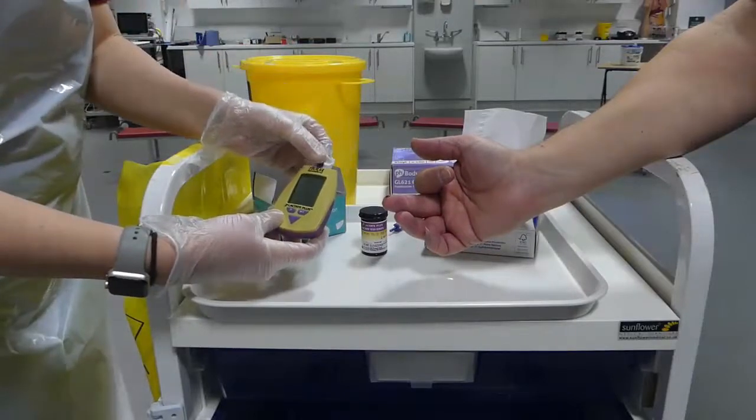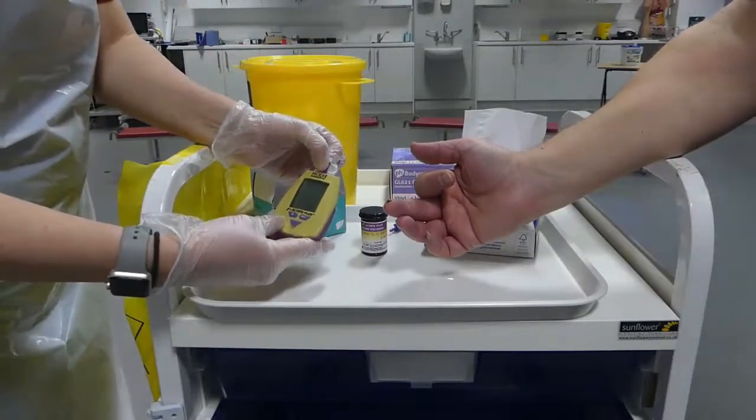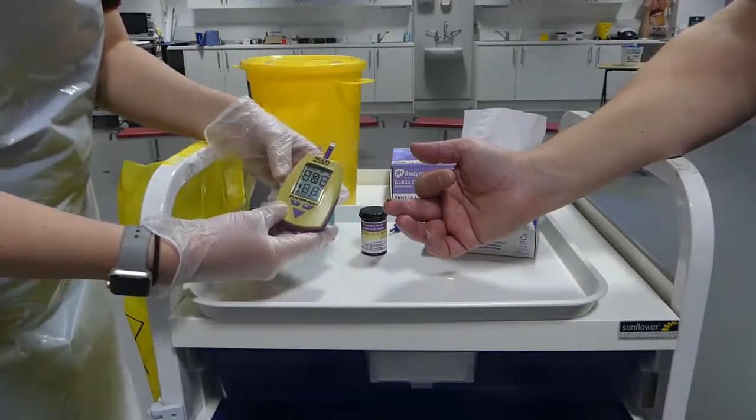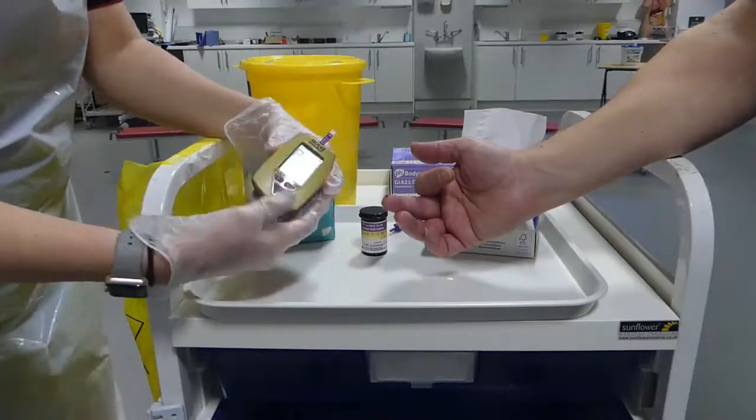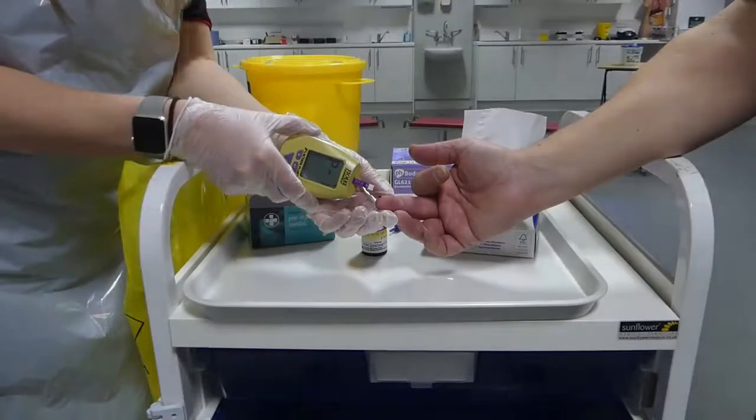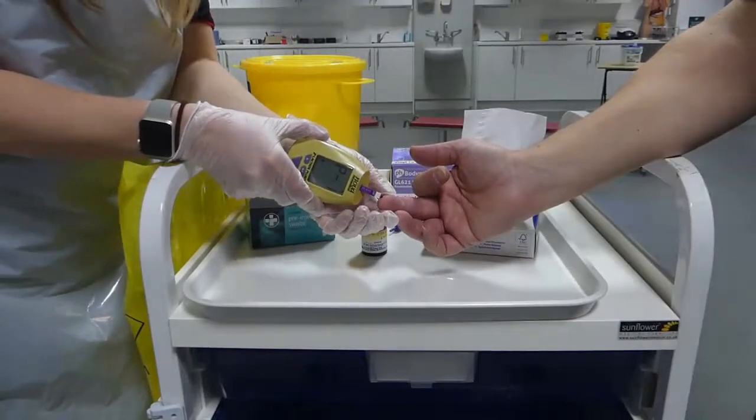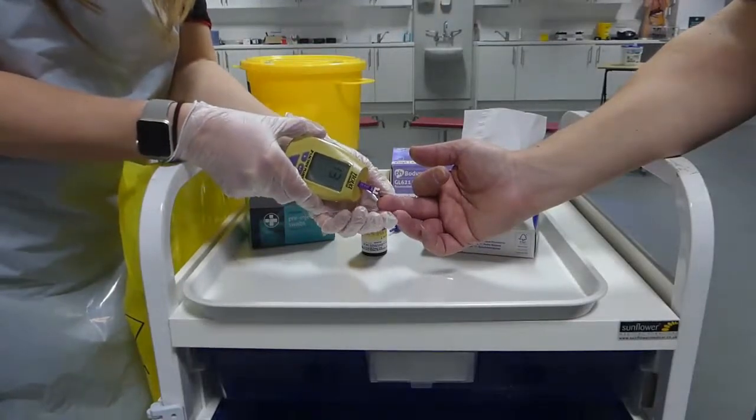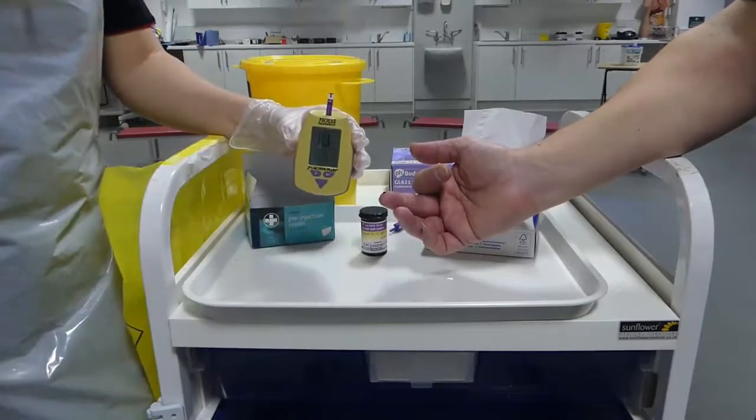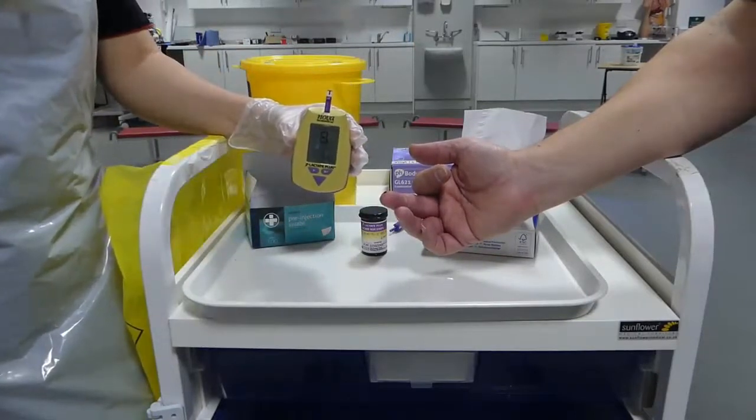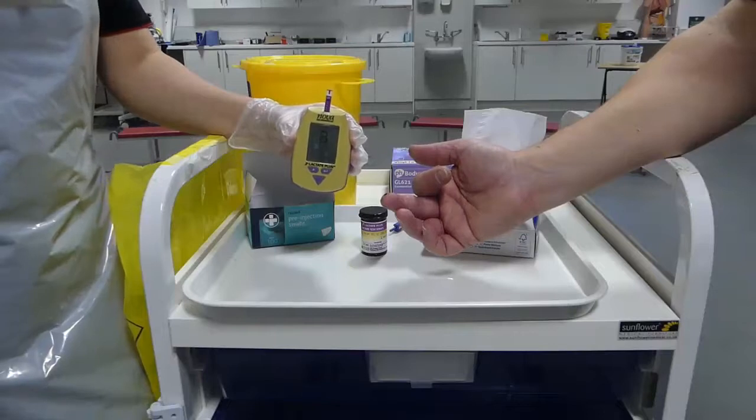Insert the test strip into the analyzer until the device comes on. Once on, place the tip of the test strip to the blob of blood and notice how the blood is drawn up by capillary action. The machine will beep once the correct amount of blood is achieved. The Lactate Plus then takes 13 seconds to provide the result.